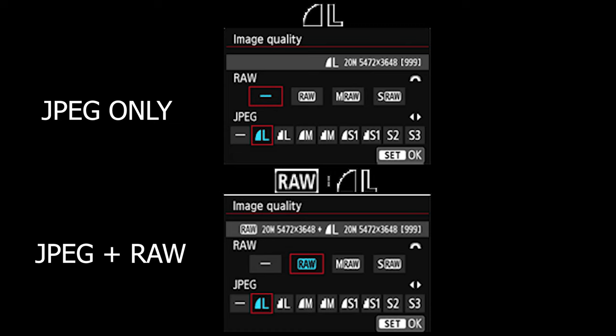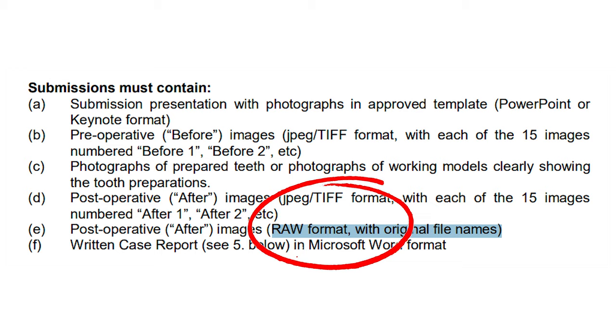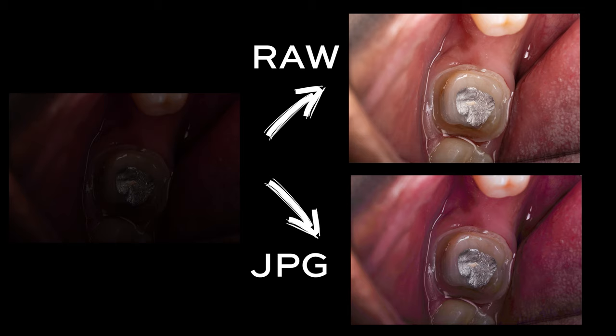Another setting I recommend changing if you're a bit more advanced is to change the file save type from JPEG to JPEG and RAW. This means it will save both file types every time you take a photo. The advantage of having a RAW file is that you can submit photos for rewards if needed, but more importantly if you take a photo that's a bit too dark you can edit it afterwards on your laptop and bring up the brightness — this is best done on a RAW file because the file size is much larger so the software has much more data to work with.